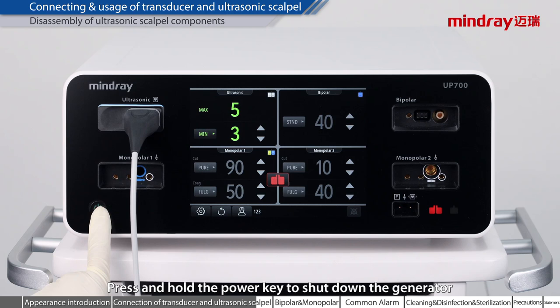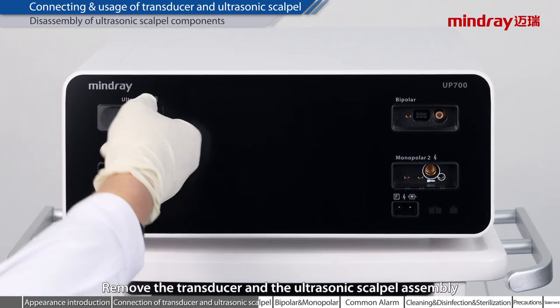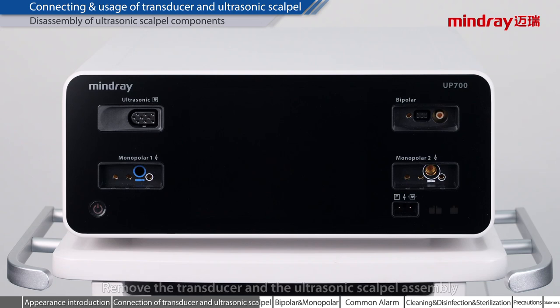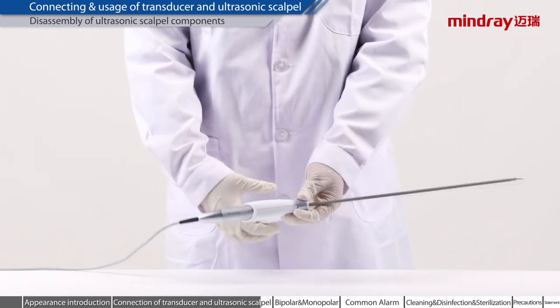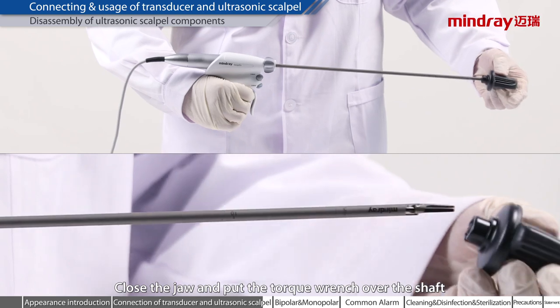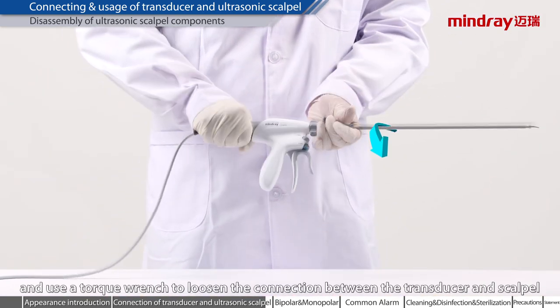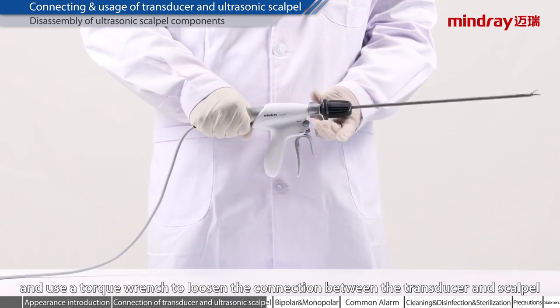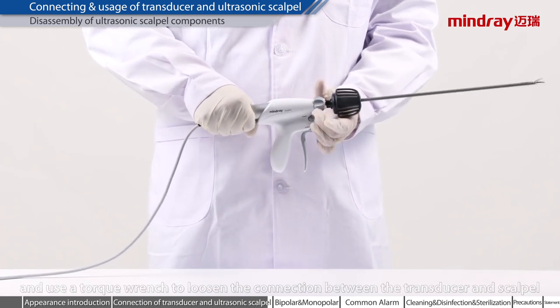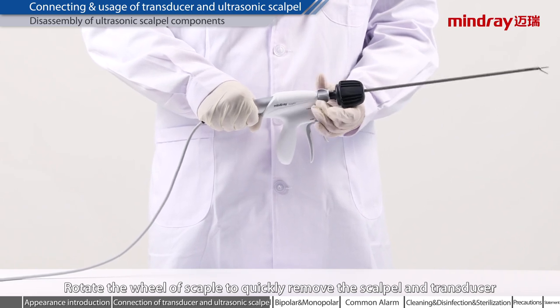Press and hold the power key to shut down the generator. Remove the transducer and the ultrasonic scalpel assembly. Close the jaw and put the torque wrench over the shaft. Hold the transducer handle with one hand and use the torque wrench to loosen the connection between the transducer and scalpel. Rotate the wheel of the scalpel to quickly remove the scalpel and transducer.